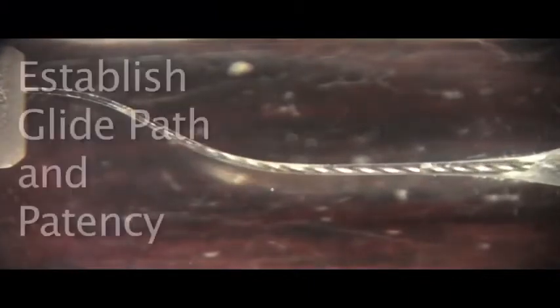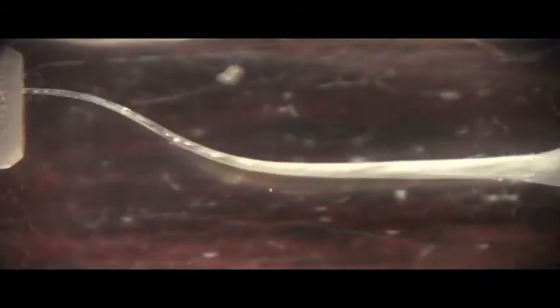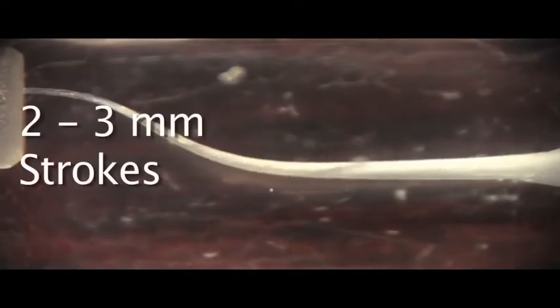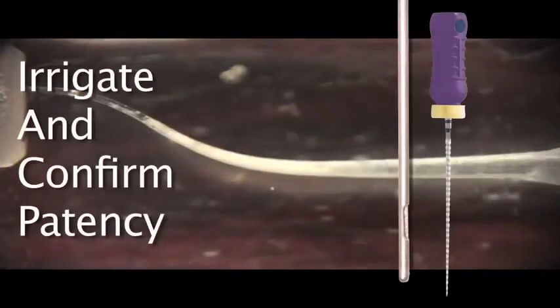Let's take a look at the Wave 1 in a plastic block. We start with K-files to confirm the necessary patency and glide path, common to all root canal shaping techniques. The Wave 1 is introduced — as always with appropriate irrigants — and taken with a few pecking motions of about 2 to 3 millimeters into the canal space. The file is withdrawn, cleaned, and inspected, and the canal irrigated.